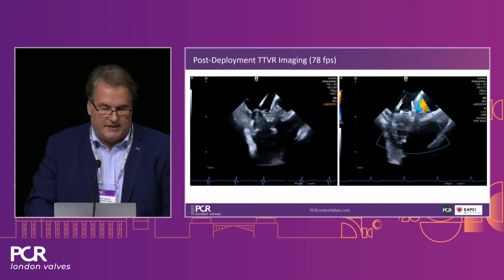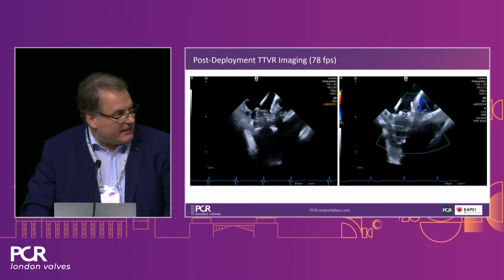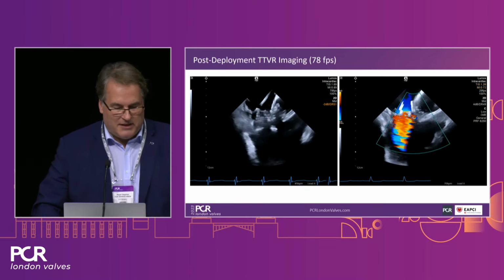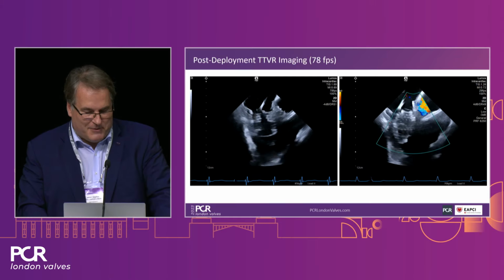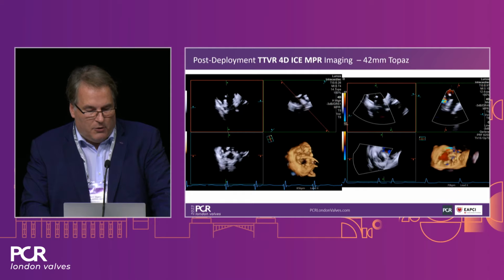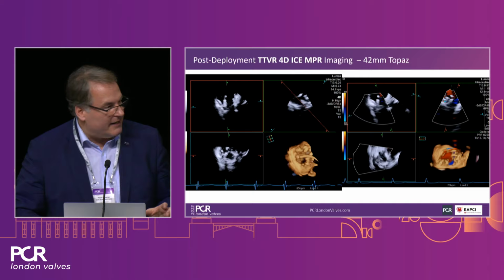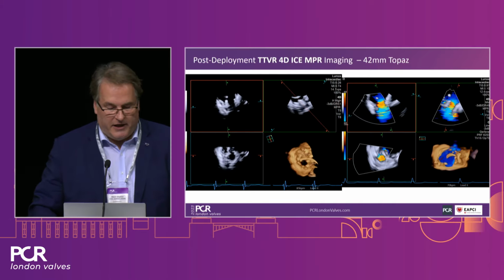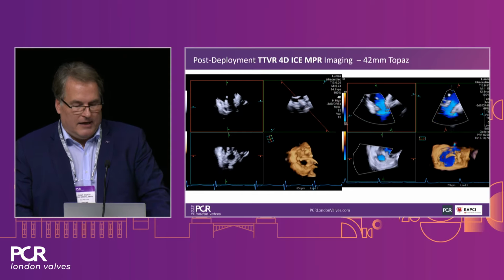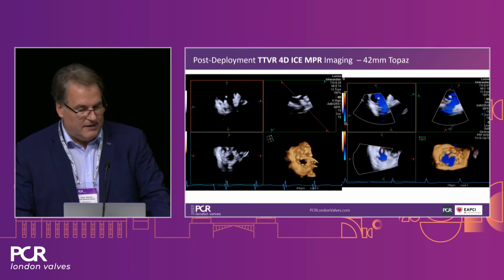And also here you can see excellent images, and we have 78 frames per second on the black and white image. So we're going even beyond what was announced by Martin, which was 60 frames per second in real world use of this device. So if we now look into details, and again, I want to highlight the situation, how well you can see the now jailed pacemaker here. If you look into the lower right image of the left side, you can nicely see how this pacemaker cable goes to the stent situation.